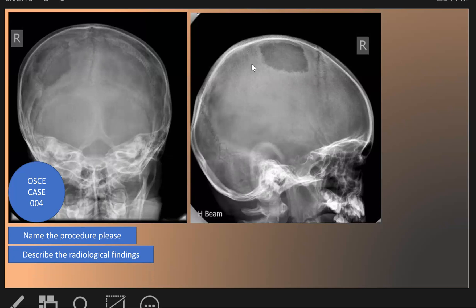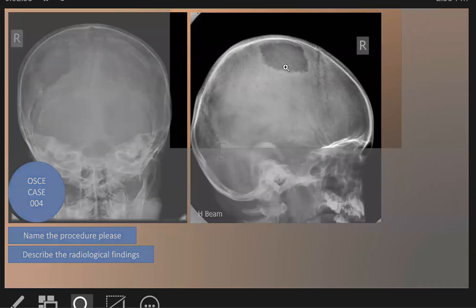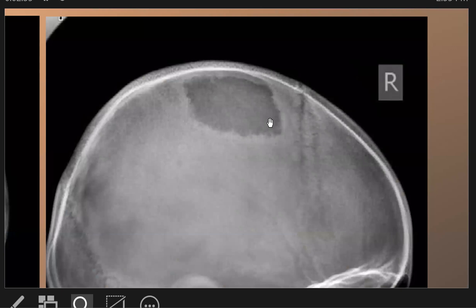We see a lytic region and a sclerotic region, as seen here in the Towne's view and on the lateral skull X-ray. This is the lytic region, and it is called a punched-out lesion, and also it is a beveled lesion.